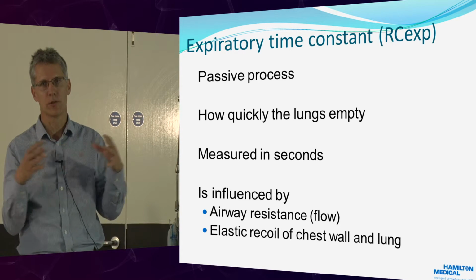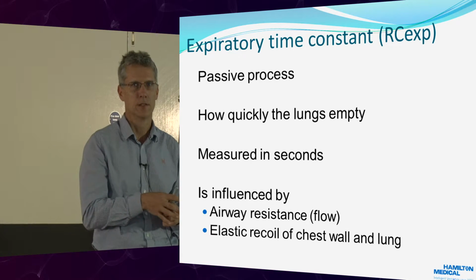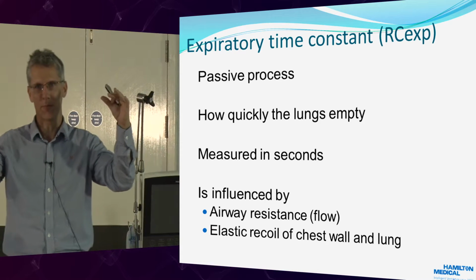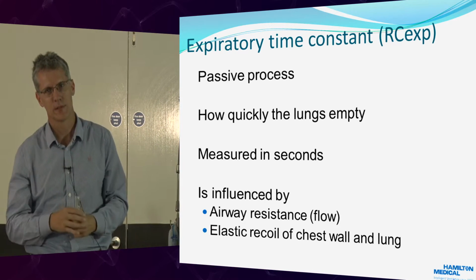And then the elastic recoil of the chest wall and the lungs, yeah? So you imagine a really stiff balloon, it's going to go boom. You imagine a big floppy COPD pair of lungs, it's going to go brrr.